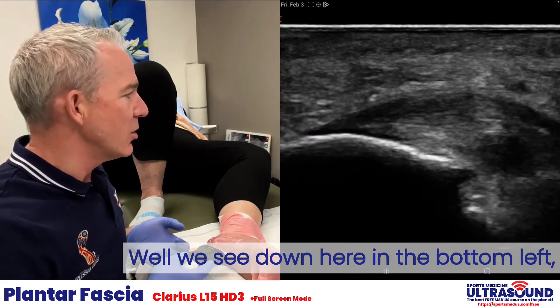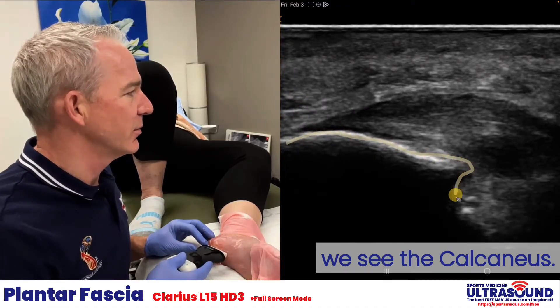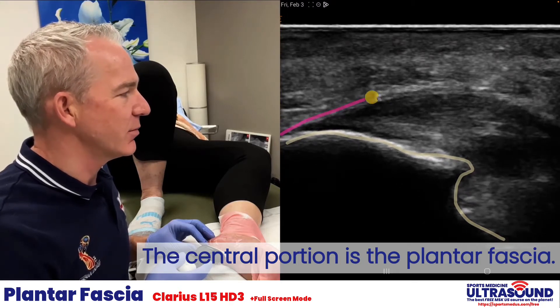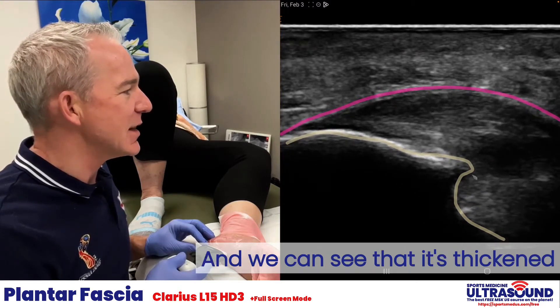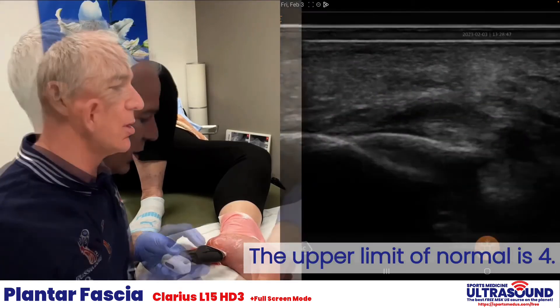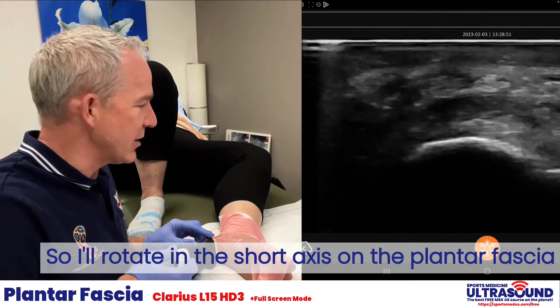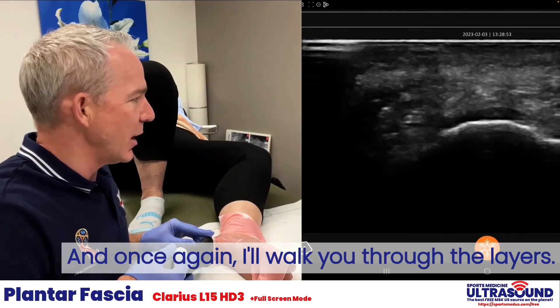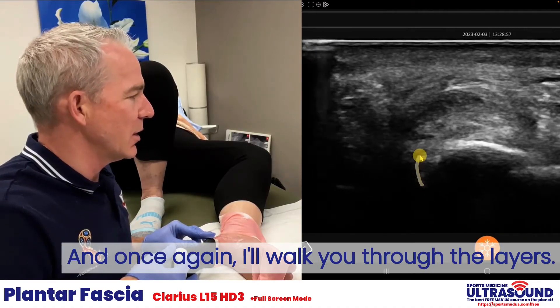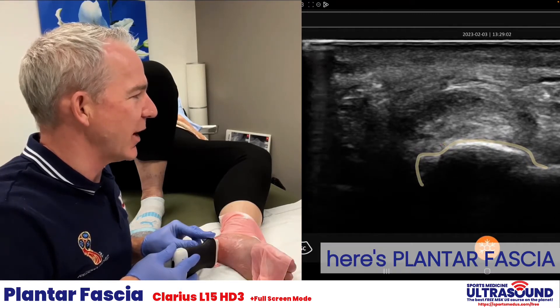So what do we see? Down here in the bottom left we see the calcaneus. The central portion is the plantar fascia, and we can see that it's thickened well beyond four millimeters — the upper limit of normal is four. I'll rotate into the short axis on the plantar fascia. Here's the calcaneus, and here's the plantar fascia.